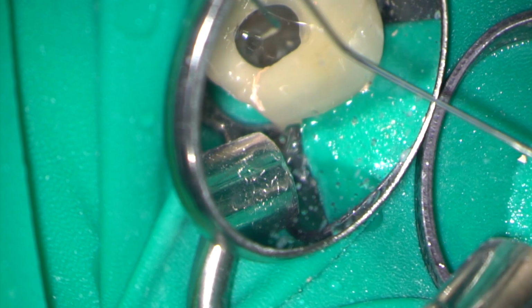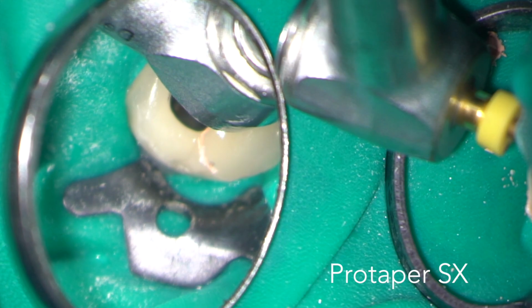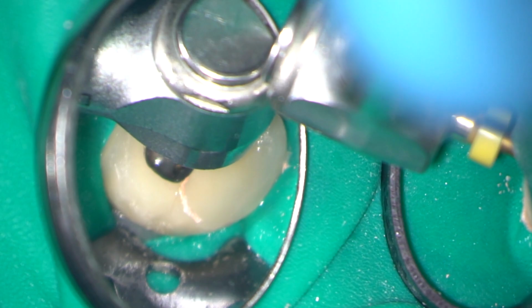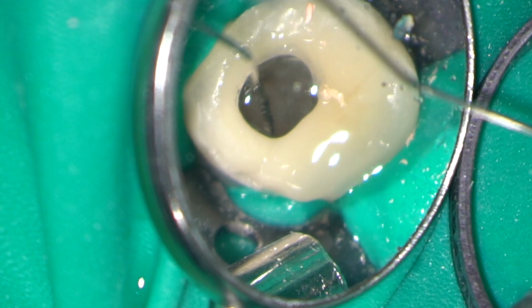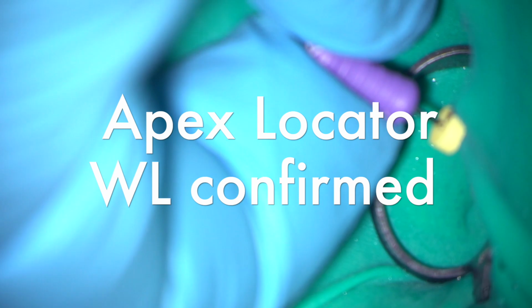Gates Glidden 2 is a very efficient way of removing GP from the coronal part of the root canals. The gutta percha in the root canals was quite soft and easily thermoplasticized. I was able to continue its removal using a ProTaper SX instrument. After confirming my working lengths using an electronic apex locator, I rapidly tapered all the canals using small and primary WaveOne Gold instruments.